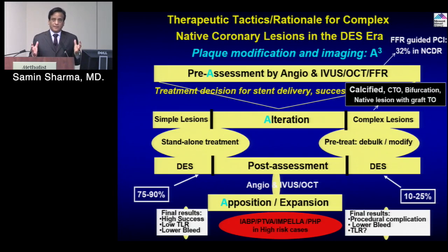And after you have deployed and done your technique, particularly in complex cases, besides just an angiogram, you do additional tests, IVUS and OCT. Particularly OCT with the bioabsorbable stent, you have heard about the BVS saga, the Absorb 2 trial with a high event rate at 3 years because they used the technique but not really the optimization of imaging. And of course, Absorb 3 and 4 data will be coming soon to see whether BVS will have any role in our clinical practice.